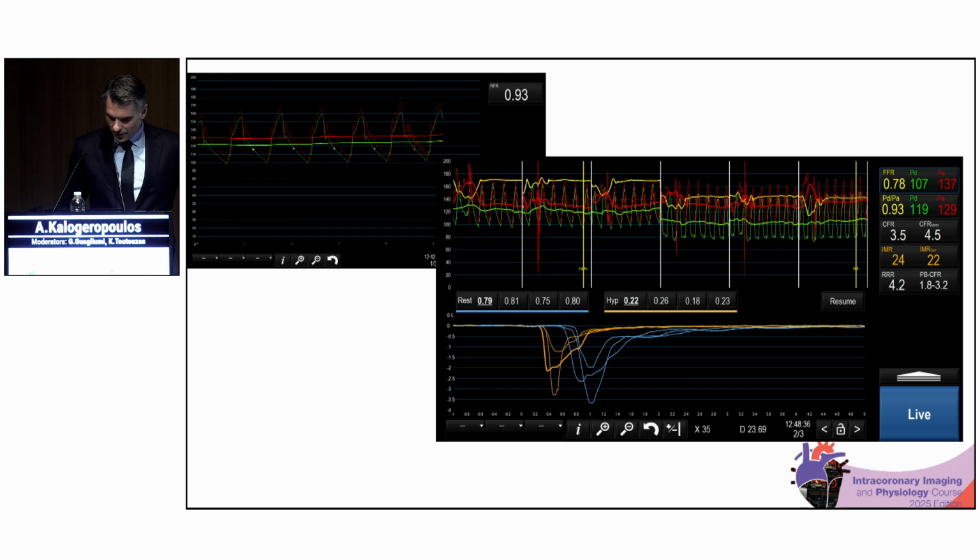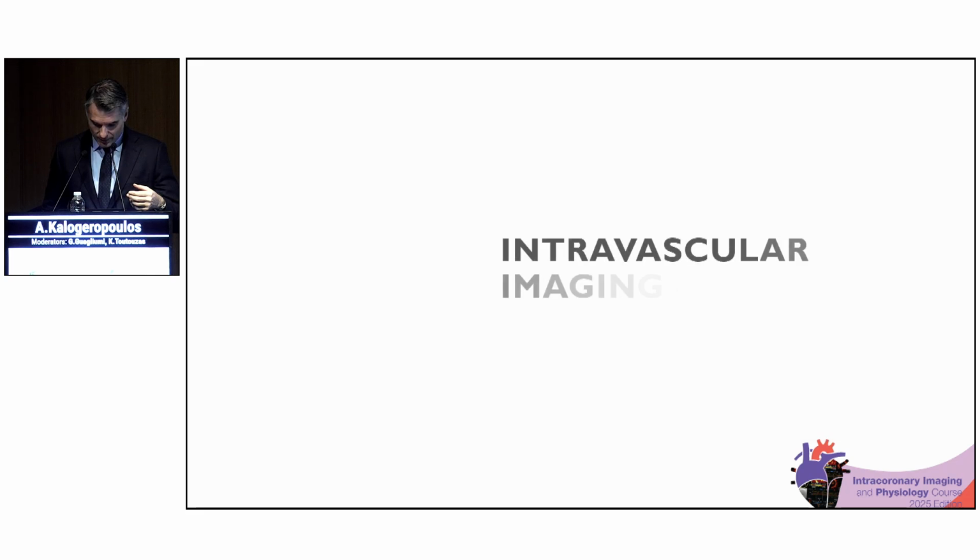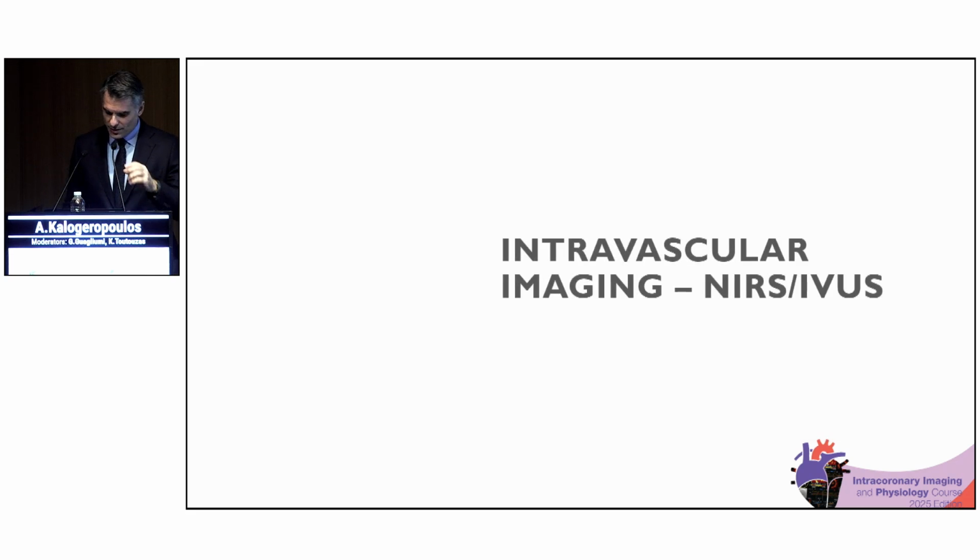So I completely agree. I was not sure either, especially with this discrepancy. Young patient, what are we going to do now? Put stents? What are we going to do? So next step, intravascular imaging. And now we have the capacity to use this new cutting-edge technology, which is a dual modality catheter utilizing intravascular ultrasound and near-infrared spectroscopy.